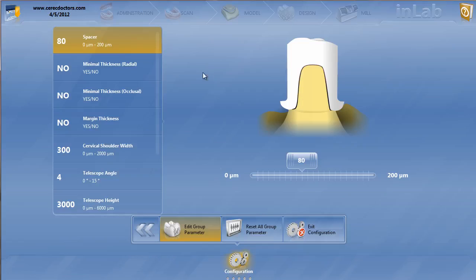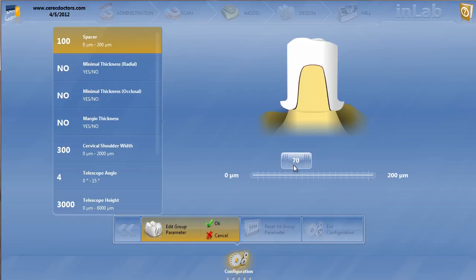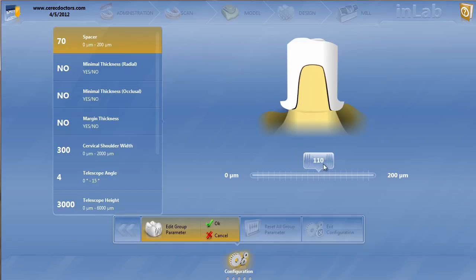So if we go through these parameters for the telescope, spacer, same as always. Generally I'm creating these telescopes out of Emax. You certainly can do them out of zirconia. If I was doing it out of zirconia, I would actually lower it because generally I like to cement zirconia. So when I cement, I lower the spacer. If I bond, I raise the spacer.